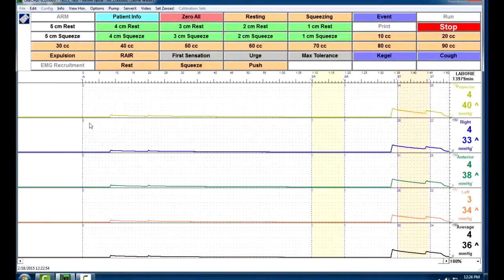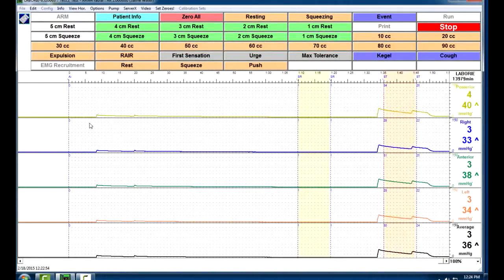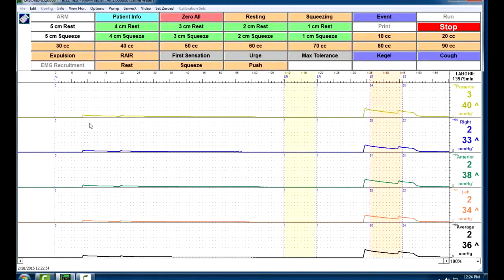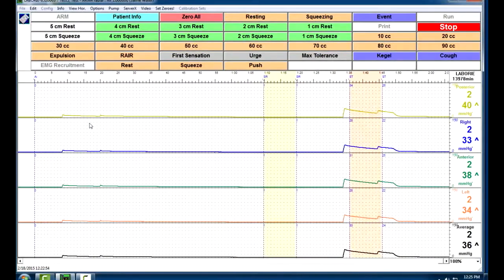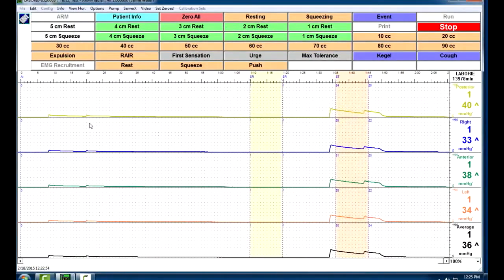And then that'll bring them back down to the baseline again. That can be very hard for the patient to do. It's difficult to hold the muscles tight like that. And just so that you know, we're simulating this using a pressure chamber. So these pressures are looking kind of odd. This is not exactly how you would see it.